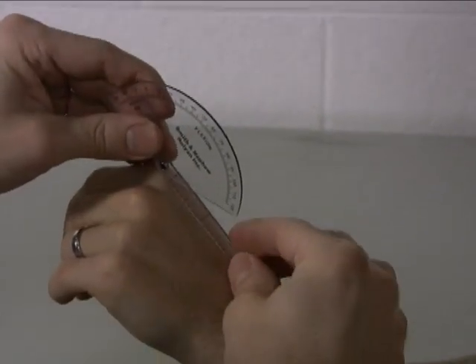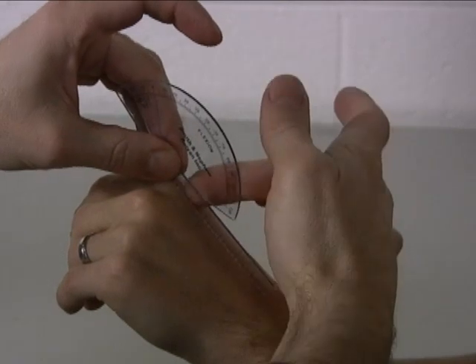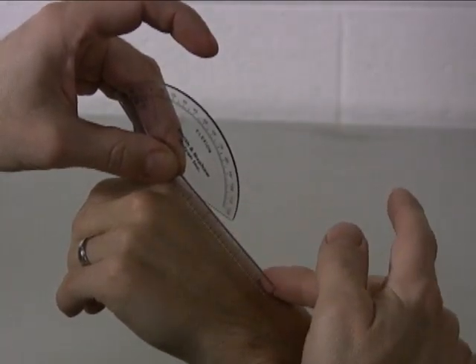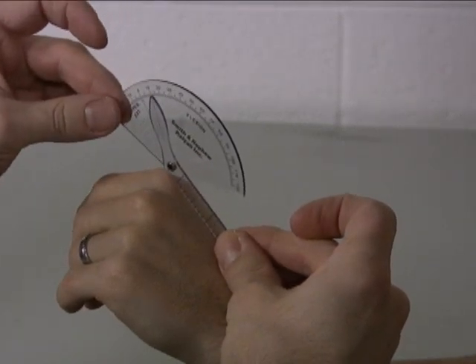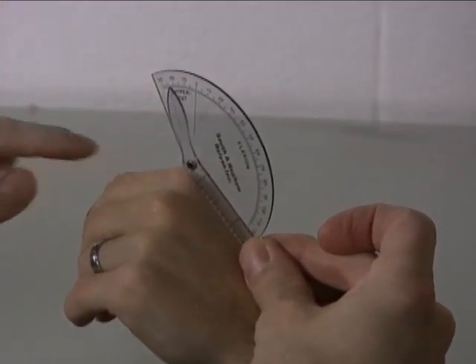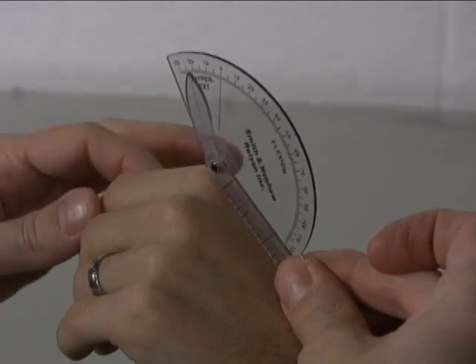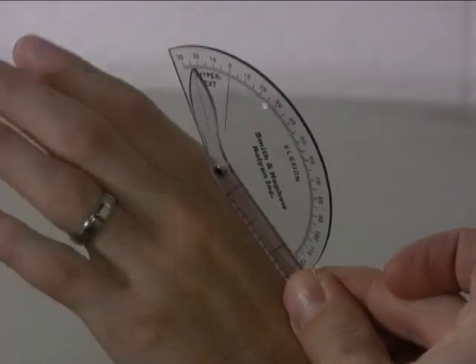The stationary arm is placed on its edge over the length of the metacarpal of the finger that's being measured. The moving arm is placed then over the proximal phalanx. So go ahead and straighten your fingers out as far as they'll go.